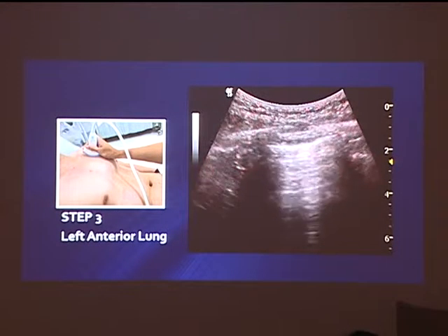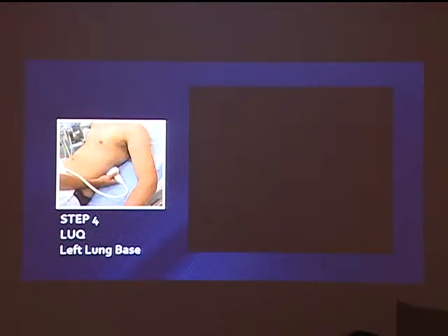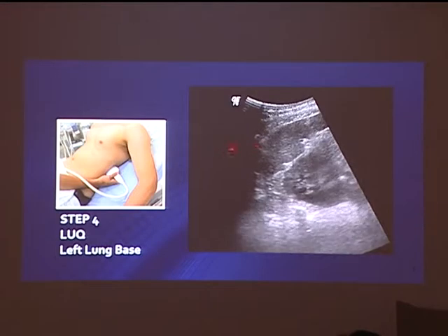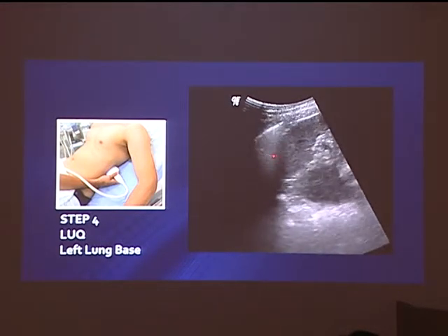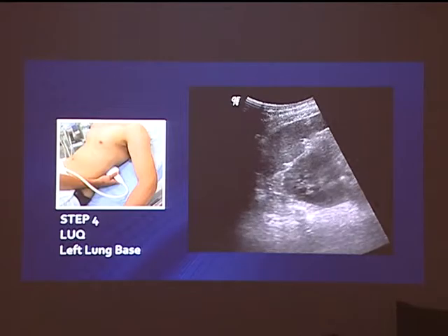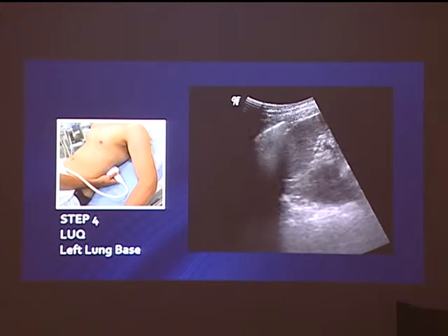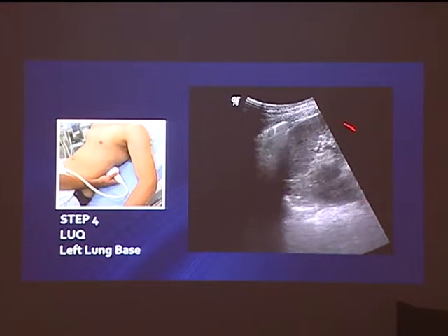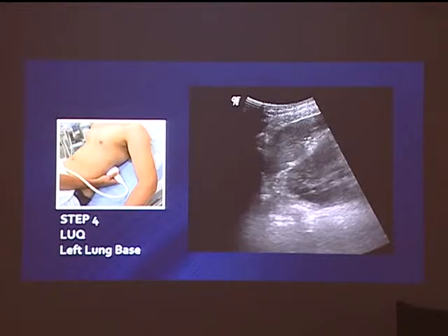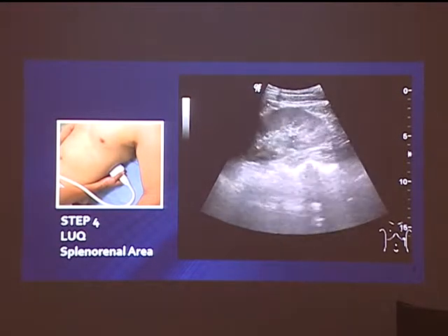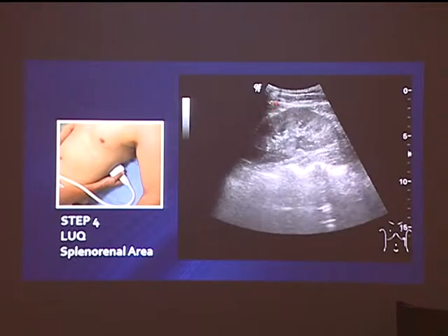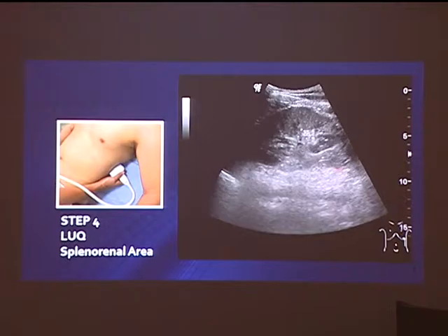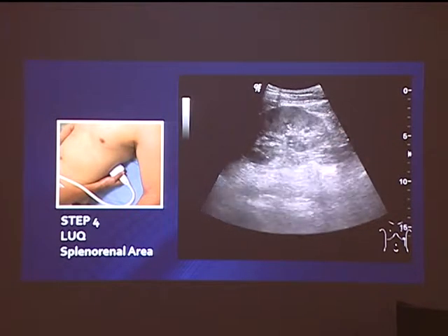On the left side, same thing — the left upper quadrant: left lung base, curtain sign, but overlooking the spleen. When you scan the lung bases, always look for the underlying organs to guide where you're looking, because if you move too far you will see confusing intra-abdominal shadows. The splenorenal space — this scan shows the splenorenal area clearly, including the inferior part, and there's no fluid collection.